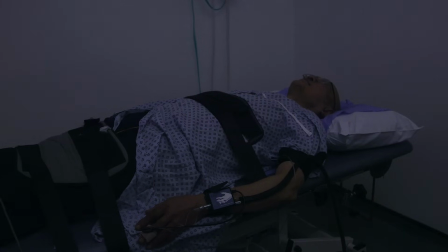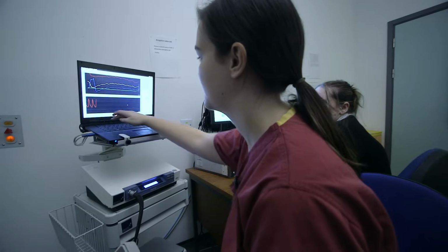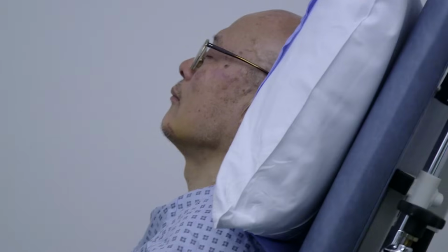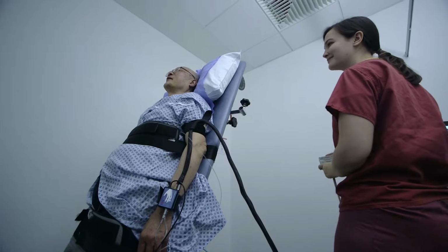Okay, so we're going to tilt you up now. Okay, should feel a little bit weird, but it shouldn't be unpleasant. Okay. So we tilt up for 20 minutes. Just relax your arm. That's it. You okay there? Oh, I'm fine.